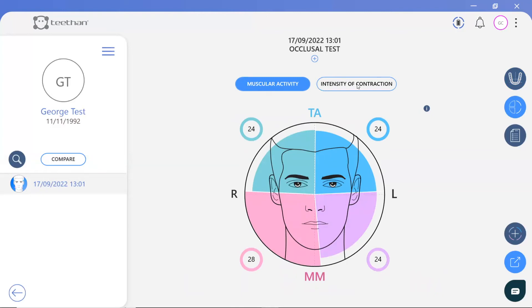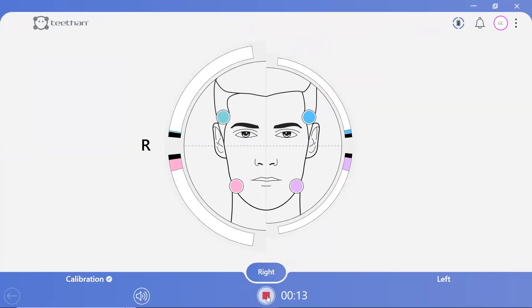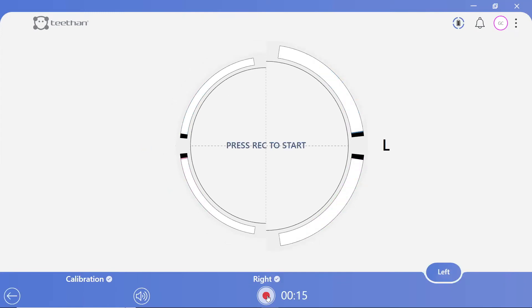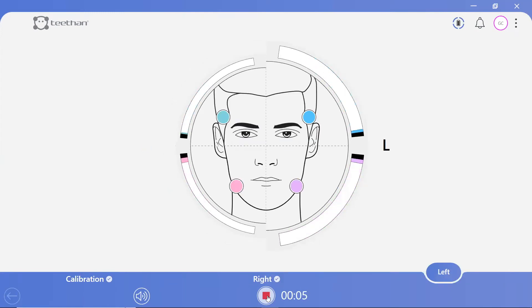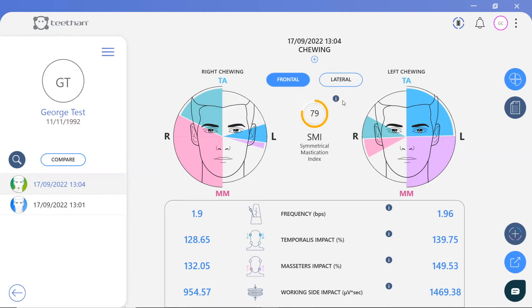Here we can see a slight prevalence of the right masseter, which is also visible by viewing the intensity of contraction display. T-VAN also allows you to assess dynamic occlusion via the chewing test. Simply provide the patient with some chewing gum and ask them to chew it until it is soft. Then ask the patient to chew only on the right side and record for 15 seconds by clicking the red button, and then repeat this for the left side. Once complete, the dynamic occlusion report will be automatically generated. The chewing test calculates the Symmetrical Mastication Index, which is the overall neuromuscular coordination during the left and right side measurements, with an ideal value of 100%. Optimal coordination is when the activation of the temporalis and masseter muscles of the chewing side are evenly distributed.